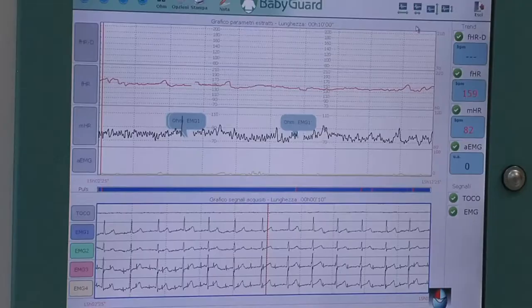I segnali, elaborati con un preciso software, visualizzano sul monitor la frequenza cardiaca fetale, la frequenza cardiaca materna e l'attività miografica uterina.